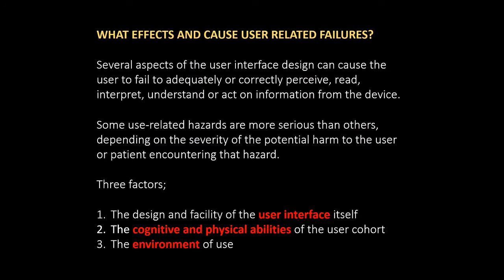So what are the effects and causes of user-related failures? Basically, we're trying to make sure that the user interface design doesn't cause the user to fail to adequately understand or perceive what's going on with the device. Some user-related hazards are more serious than others, and that depends on the severity and the potential harm to the user. There are three main factors which contribute to the success of a user interface.